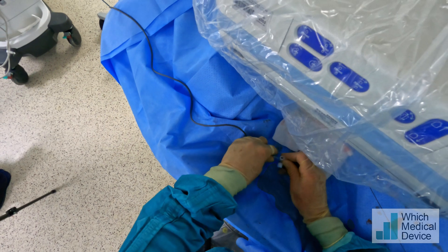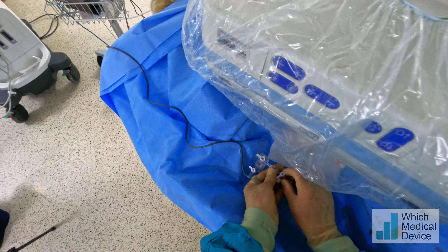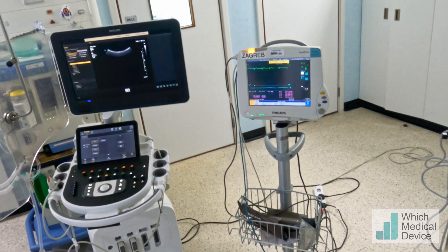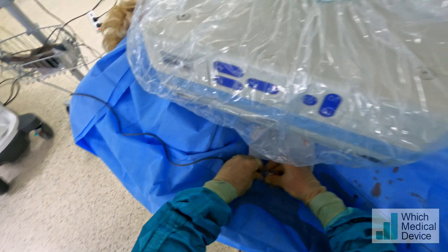We'll connect up to the pressure gauge — we don't need to re-zero. We'll open to the patient. Nothing's changed. The portal venous pressure is 15, so it's gone from 13 to 15 after infusion of the islets. We'll turn that sheath off and disconnect the pressure gauge. Now what we're going to do is plug the tract.